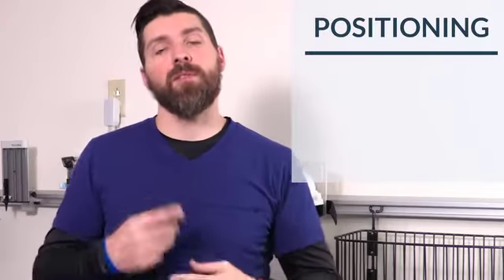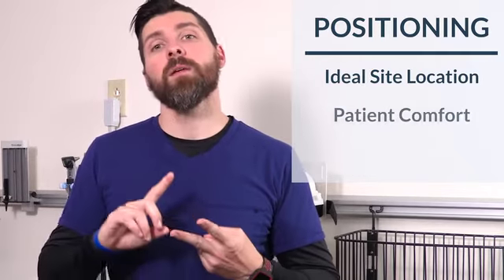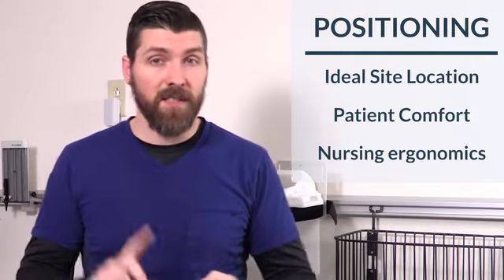This lesson, we're going to talk about patient positioning as it relates to your IV placement. What you want to do is think about three things whenever you're looking at your patient's position. The first one is ideal site location. The second one is patient comfort. And the last one is nursing ergonomics. So let's take a look at the first one.